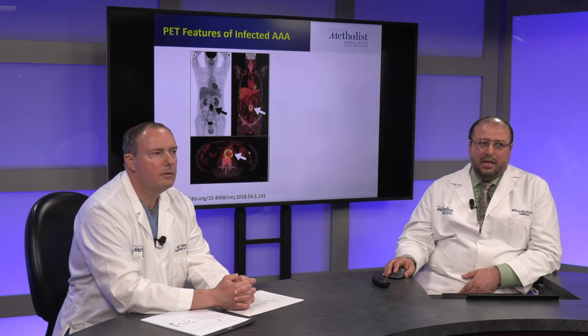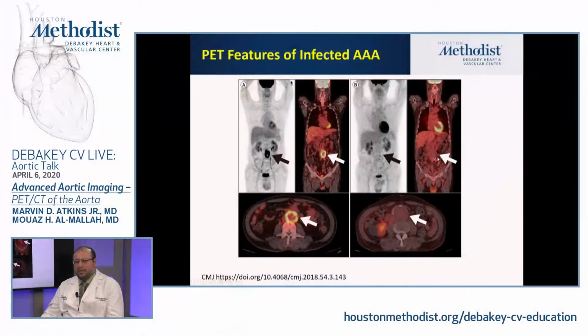Great. And this is another patient who did not have an intense uptake but also has an inflammation, as you see in the aorta. So here the uptake, this one is more intense, this is less intense in this patient. So there is some uptake, but it's less intense, so a kind of differentiation between the two.